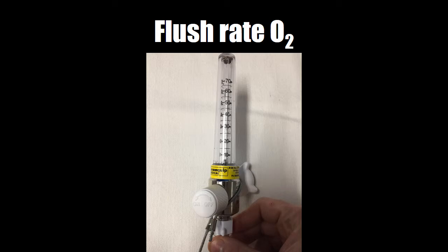But what we can do is change the flow meters out. So this actually is in Sunshine ED at the moment. I took a picture of this earlier on in the week. As you can see, it's got a wire, because people steal these things, and it's actually wired to the Airvo high flow nasal cannulae to stop it going walkabout. But this will give us a flow of 70 litres per minute, and you can overcrank this, so you can get way over 100 litres per minute if you overcrank this.